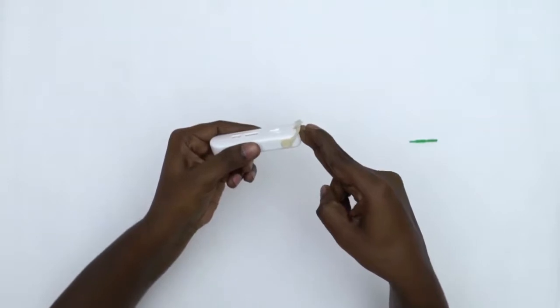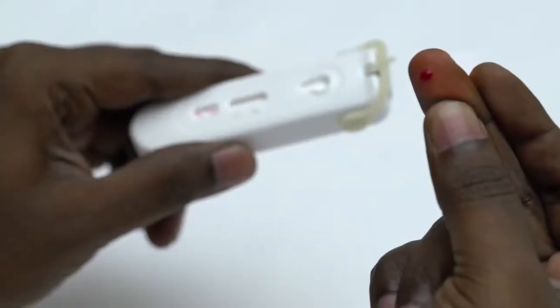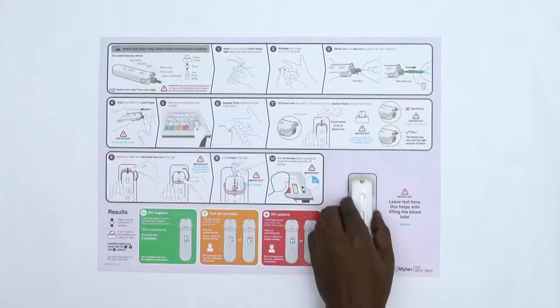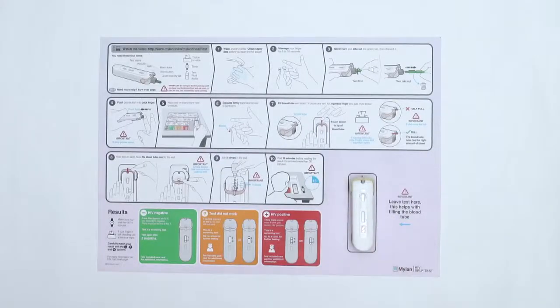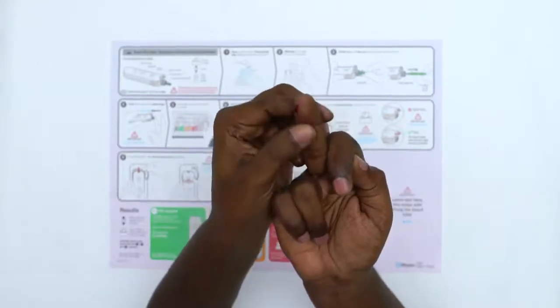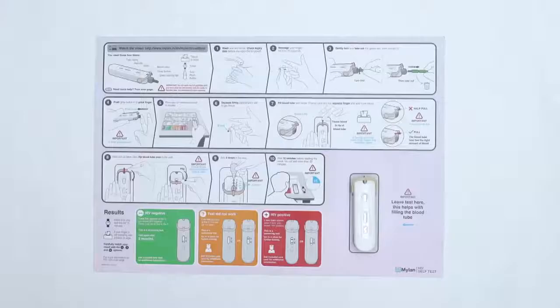To most people, the prick feels like a rubber band snap against the skin. Now place the test down on the instructions sheet in the bottom right corner — this will make it easier to fill the tube with blood. Squeeze firmly behind the prick site on the finger. For the next step, you should not pick up the test; it should stay on the table.